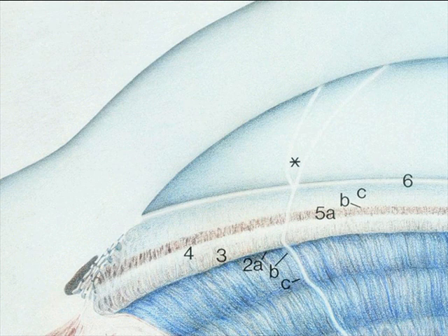Here's another drawing of what we can see gonioscopically. And this is sort of a 3D view with a side view as well. And what we can see in the asterisk, we're going to talk about in a little bit. That's where the anterior and posterior sides of edges of the light beam on the cornea come together. This is known as the corneal wedge, and it always terminates in Schwalbe's line. Schwalbe's line is labeled number 6 here.